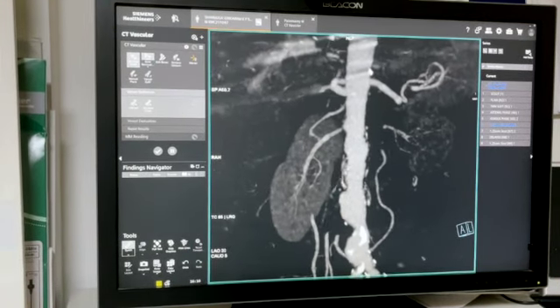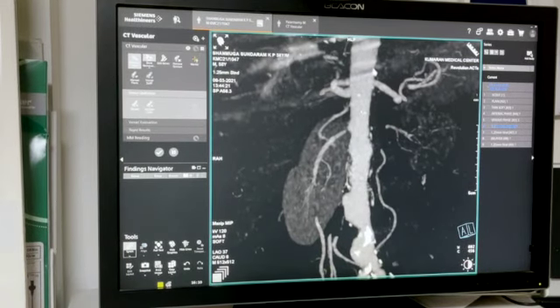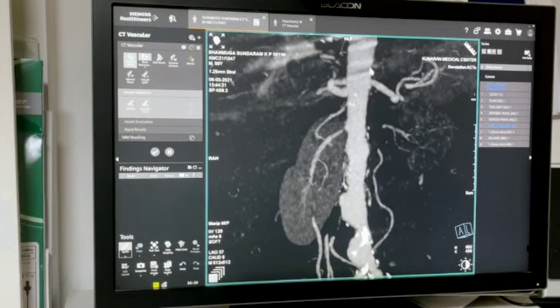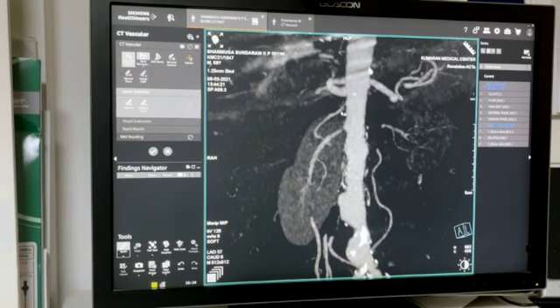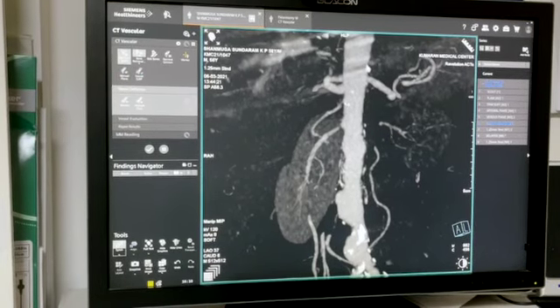Whereas in this difficult one, we actually used an internal mammary artery catheter through the renal guiding catheter. So the internal mammary artery catheter would just hook the ostium, allowing us to take the small 2 mm vessel and do a stenting for this also.